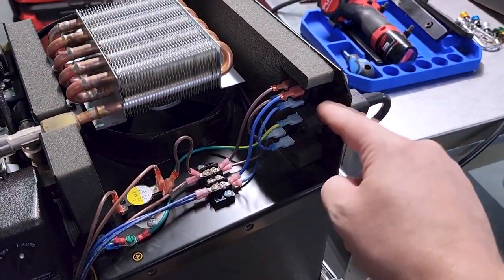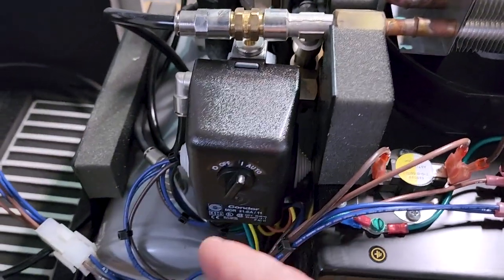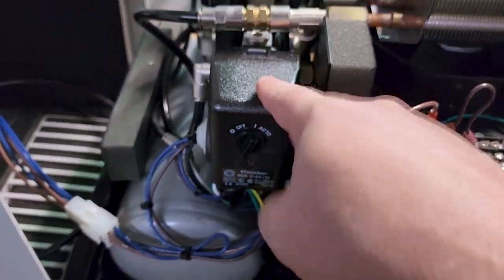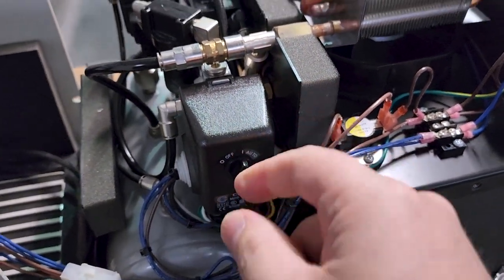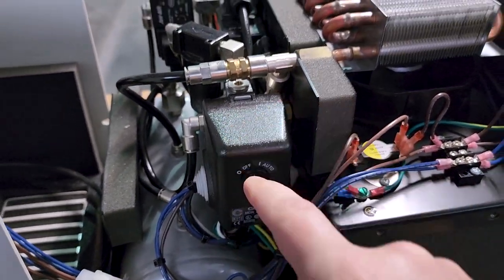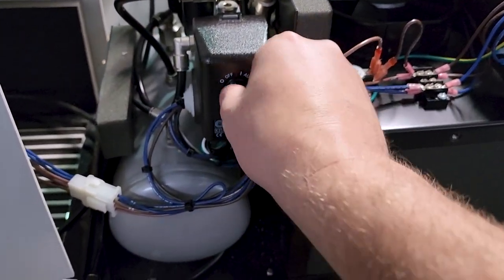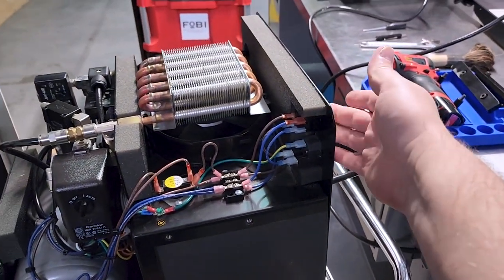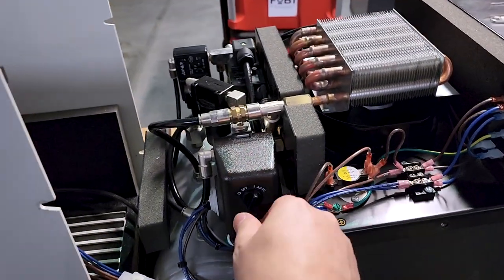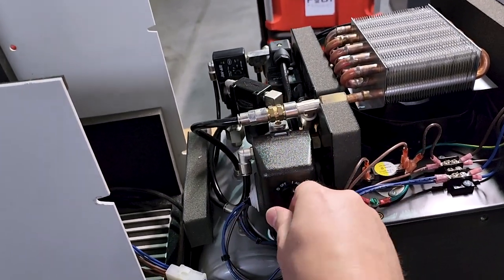This right here is your power switch. So it closes those and brings AC mains in, which I should watch because it is currently plugged in. And right here, this is your main contactor for the device. So you can see off and on, but it also serves another function. When you switch it to the off position, it purges. So you will not have constant pressure on the system if you switch it to the off position internally. Now, externally, you can kill it back here, and it will maintain pressure. But if you go internally and flick it to the off position, it will vent the system, right?